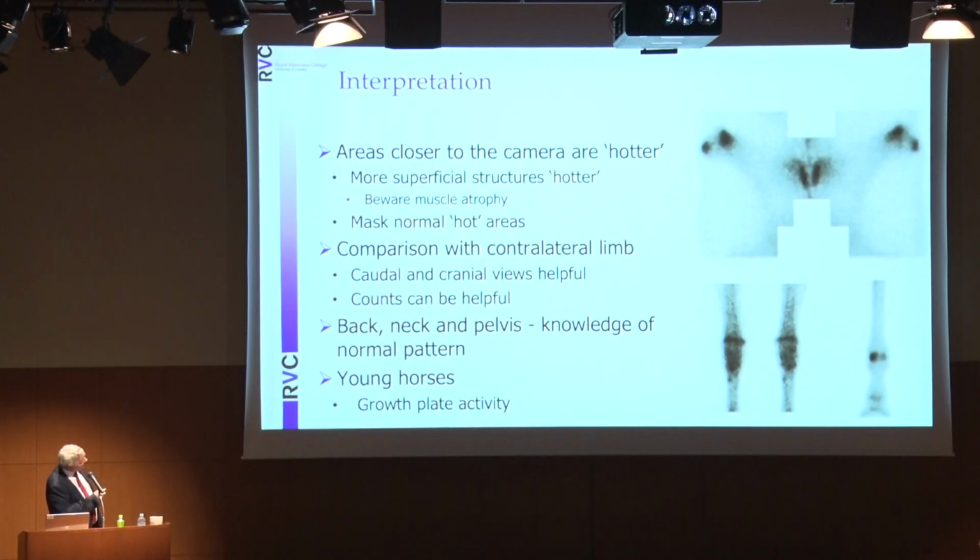For limbs, we are comparing one leg with the opposite leg. And of course, having both legs on the same view is helpful with caudal and cranial views. And also the counts in a particular area can also be helpful at determining increased uptake.